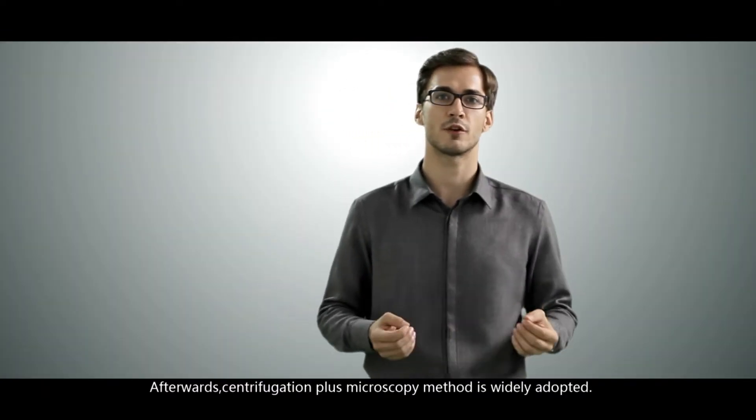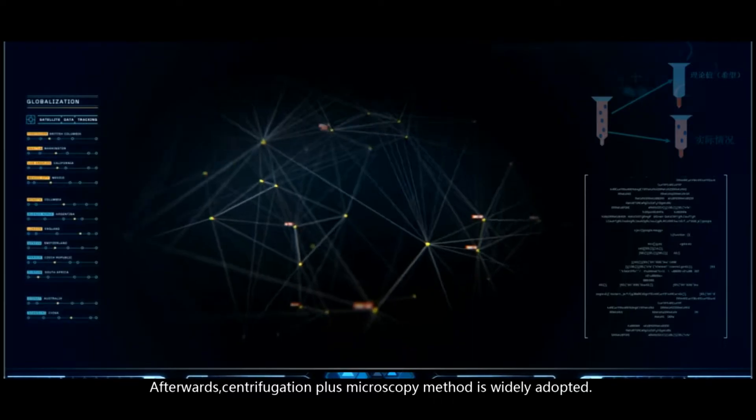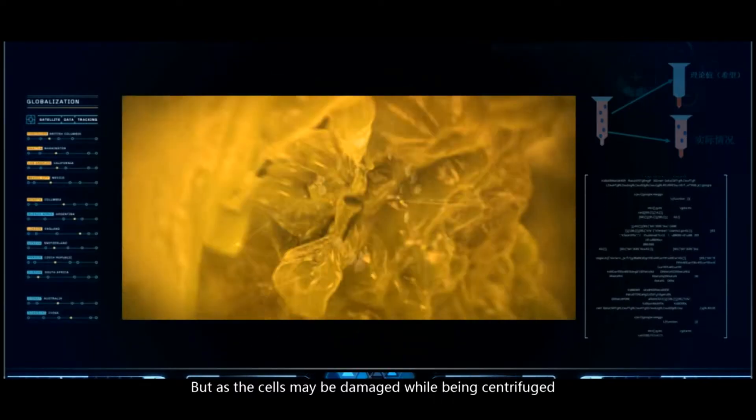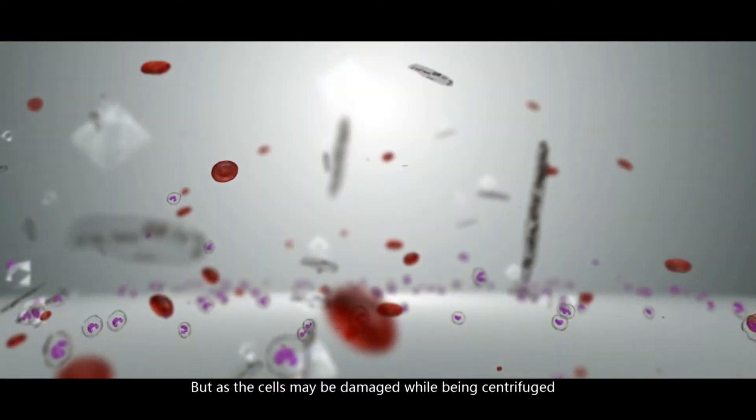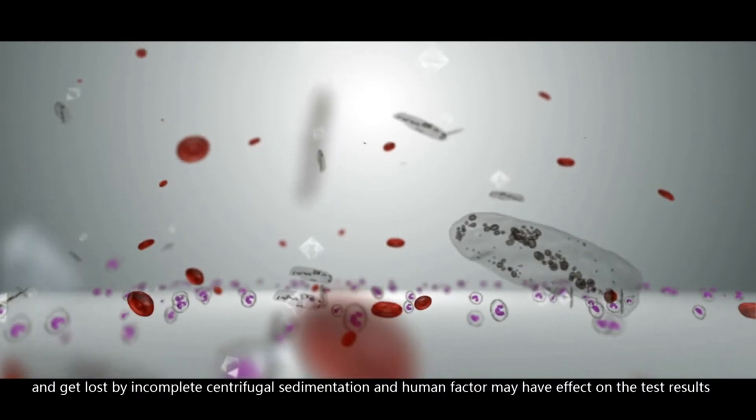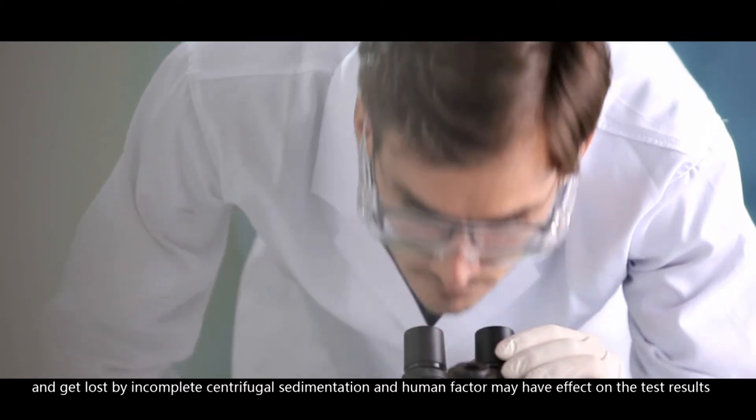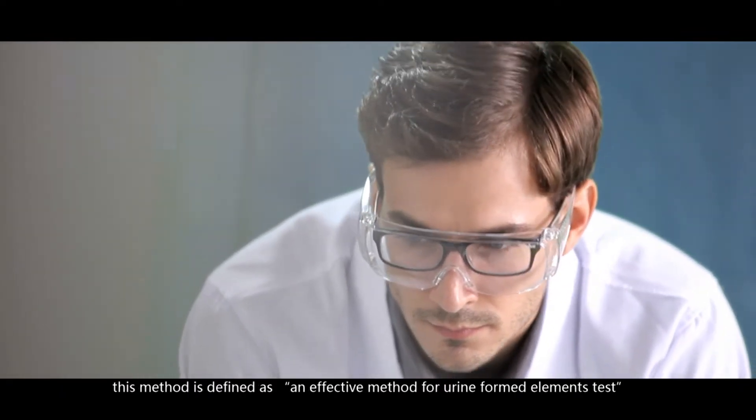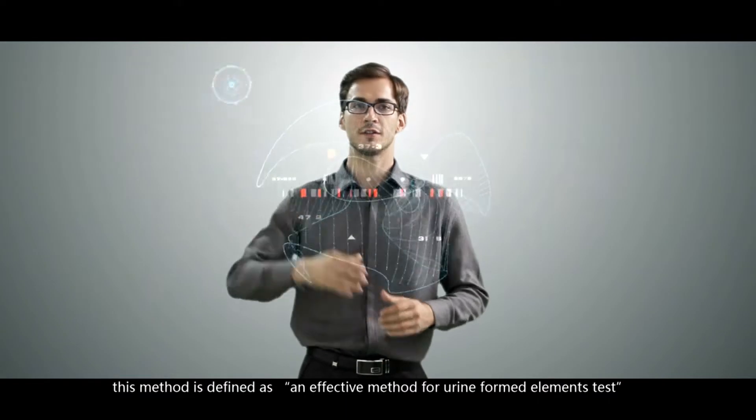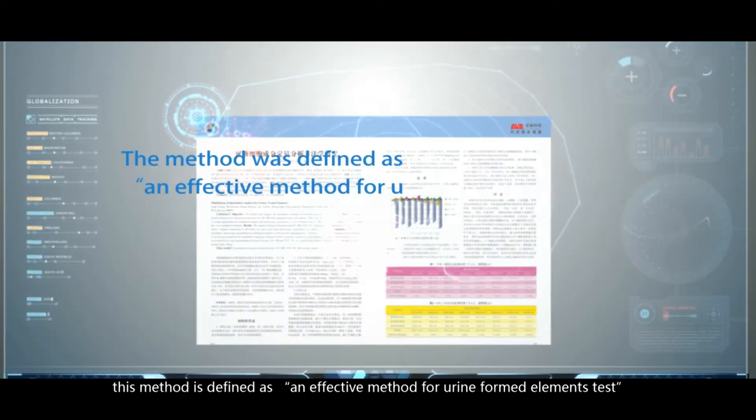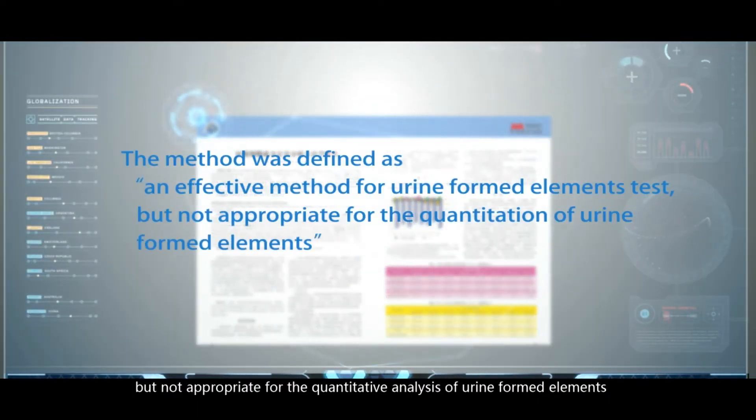Afterwards, centrifugation plus microscopic method is widely adopted. But as the cells may be damaged while being centrifuged and get lost by incomplete centrifugal sedimentation, and human factor may have an effect on the test results. This method is defined as an effective method for urine formed elements test, but not appropriate for the quantitative analysis of urine formed elements.